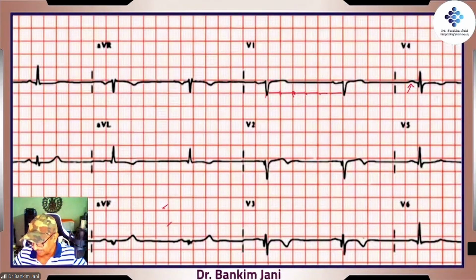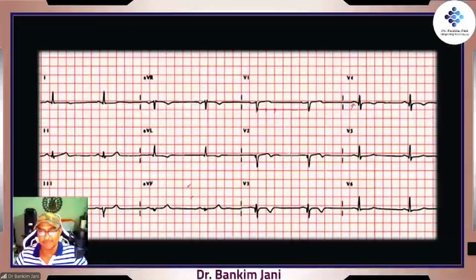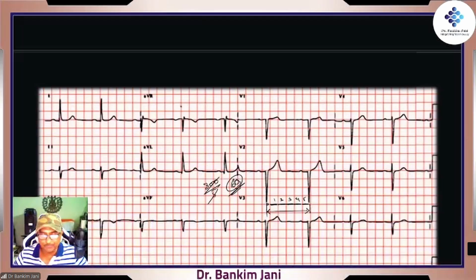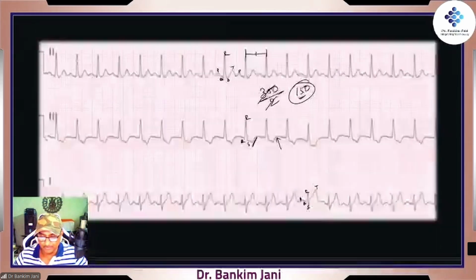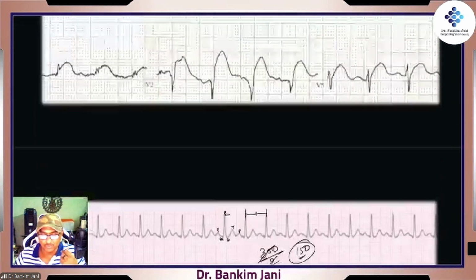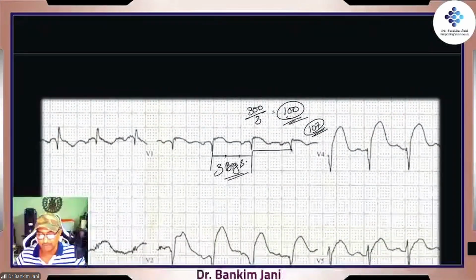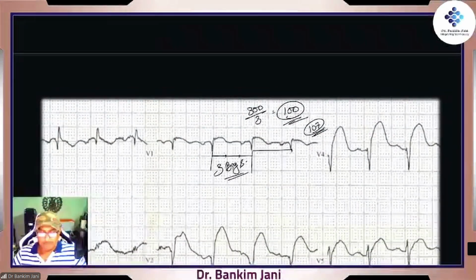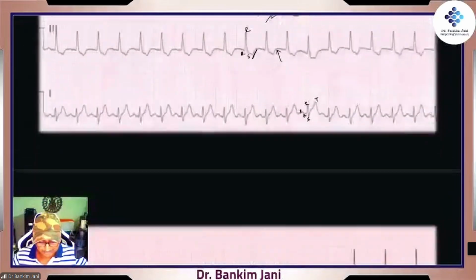So next time, that is on the day of Dashara, right, we'll be going into more details of many of the ECGs. One of the most fantastic things which we will learn is when you'll be able to visualize the heart, that the heart which is sitting inside, just by looks of the ECG, how he is sitting. So today you learned those basic concepts, plus the movement of the paper, plus the calibration, plus how to calculate the heart rate, right?